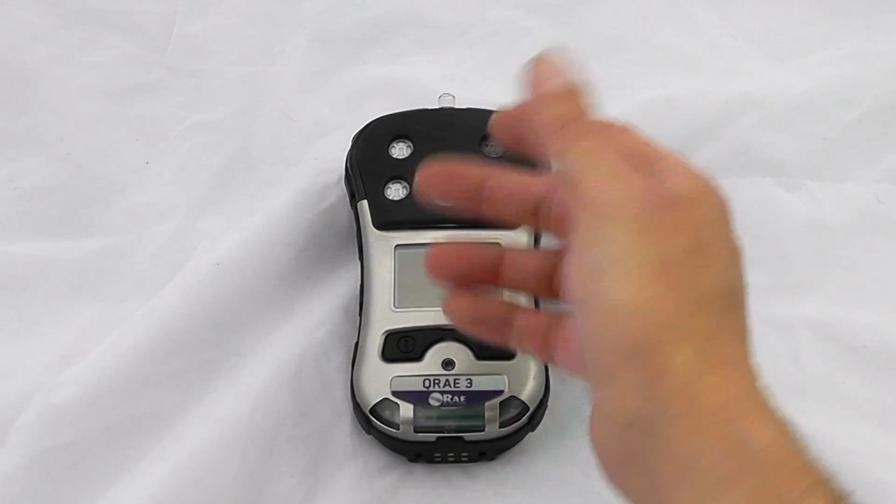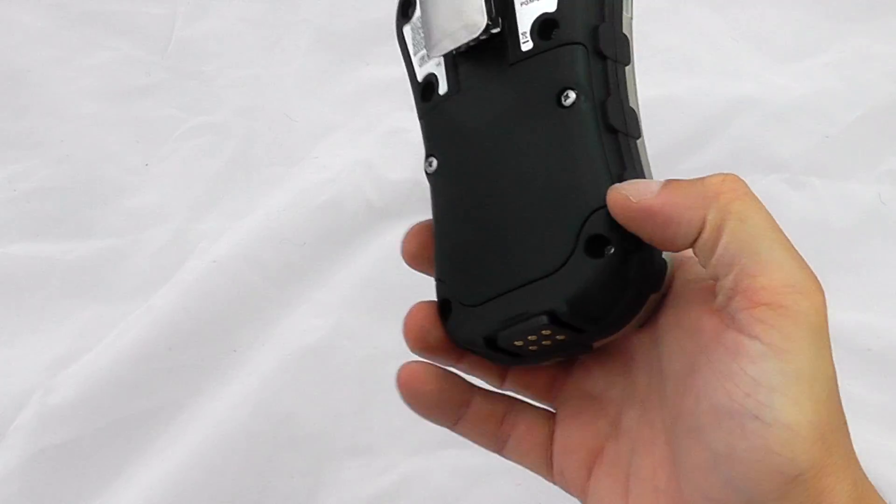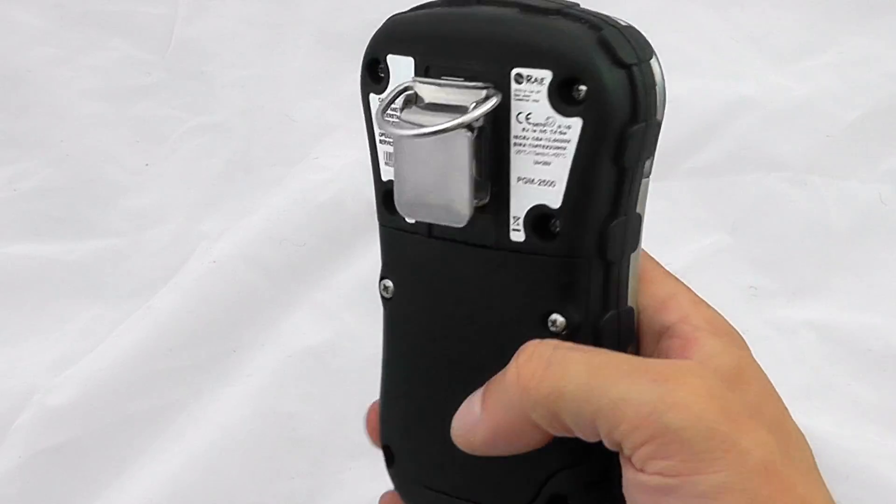The pump is based on the top of the instrument. This would also normally operate with a hydrophobic filter in place. This is a rechargeable instrument, so charging is via the ports on the bottom, and this is the rechargeable battery pack on the bottom.